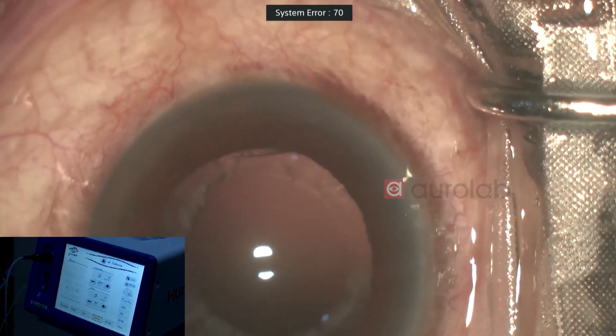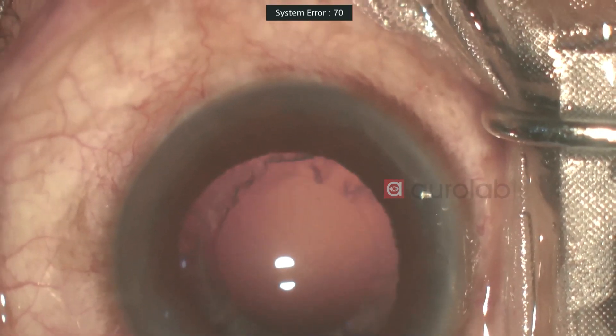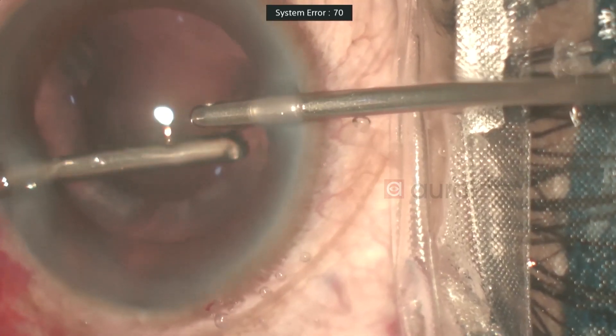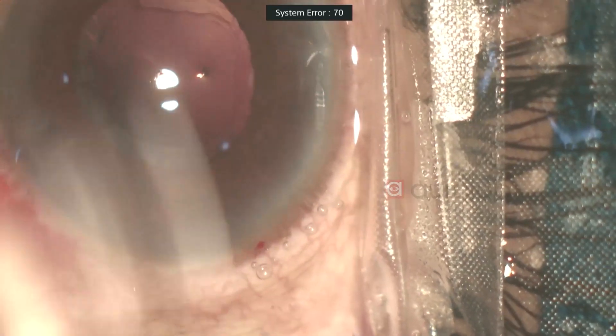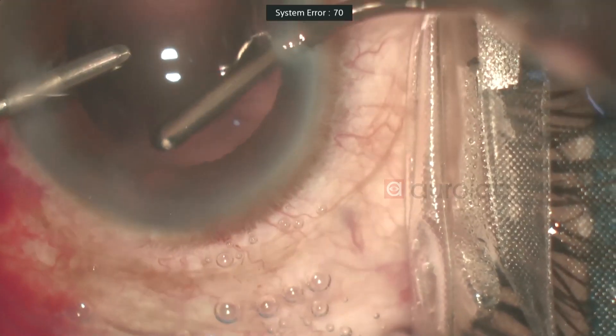We have cleared nearly all of the nucleus. A bit of the cortex is left. The EPT so far has been 14, which is pretty much okay for this grade of cataract. Now switching hands for the other side — that clears it up.